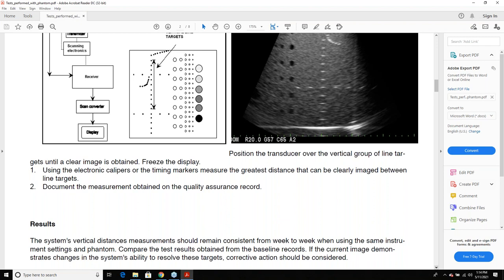What's the advantage of doing larger measurements? You'll get less variance. Well, yeah, right. So now your 2% becomes a bigger number, right? So there are some reasons that you may want to take a larger measurement than 2 and 2. We use 2 and 2, but I just like to point it out. It won't vary over distance. It'll just be how much you're moving, because just a tiny bump of the trackball and you can be 0.03 different. So it's how you're measuring it.